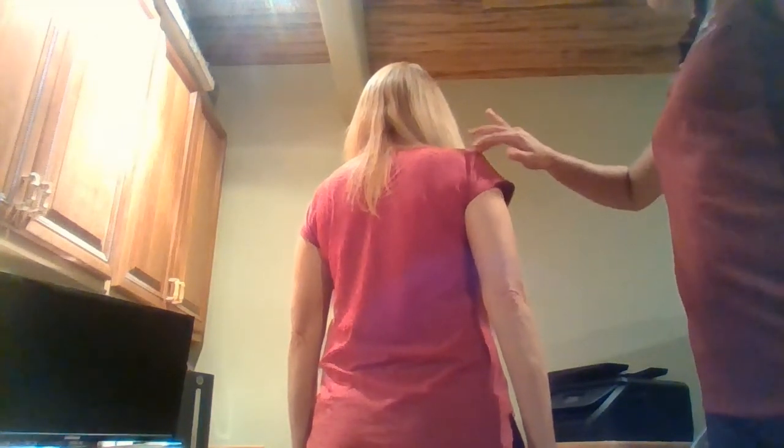First off, I'm going to mark off the different areas that we are going to be putting the skin fold caliper on. The first area is the tricep, so go ahead and turn around for me. And where we're going to measure on the tricep is about half the distance between the acromion process and the olecranon process. So I'm going to just feel that out for you.